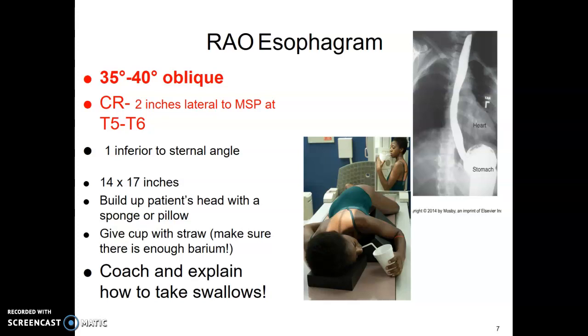The central ray is two inches lateral to the mid-sagittal plane. Find mid-clavicle on the upside, use a 14x17 cassette, and build your patient's head up so it's not tilting down. Give them a cup with a straw, make sure there's enough barium, and coach them: take sips and swallows one right after another to really fill the esophagus for this study.